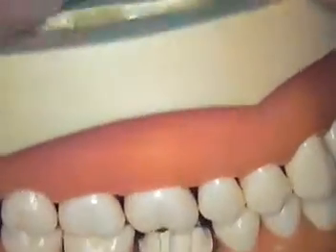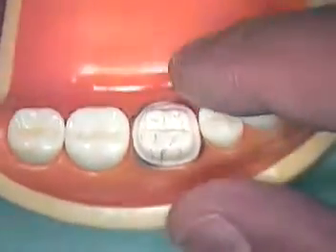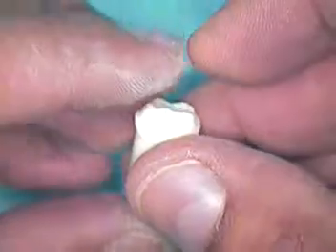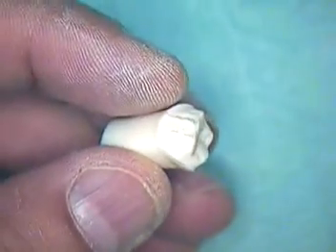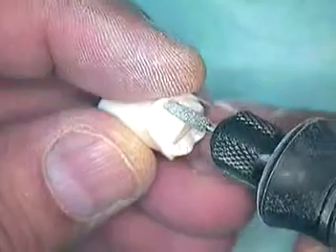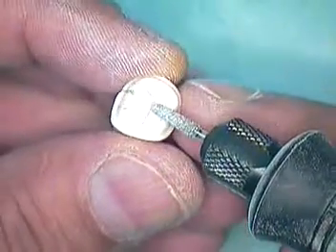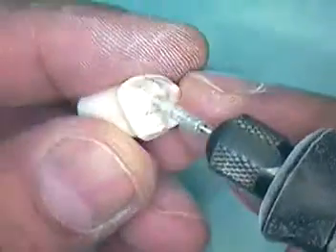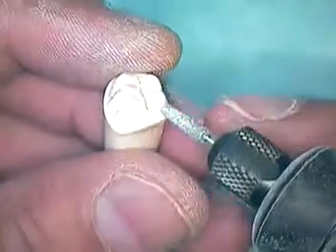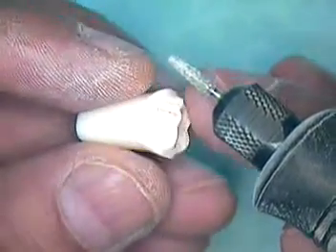This is Dr. Jerry Cuomo with the final tooth preparation now finished. One more tip a pre-dental student shared: set the machine to around six to eight and just feather the surface of the tooth lightly — literally just lightly polishing the surface at high speed — not to gouge into your nice prep, just to paint and smooth it. You can also take a rubber point or rubber wheel to polish further, though I don't really recommend that; it's not necessary at this point.